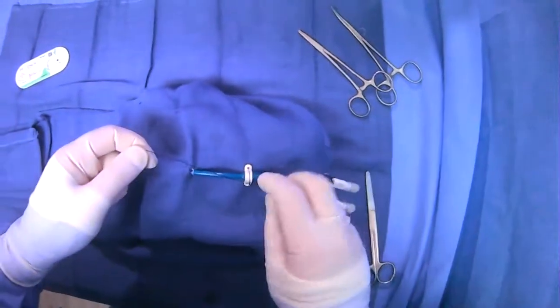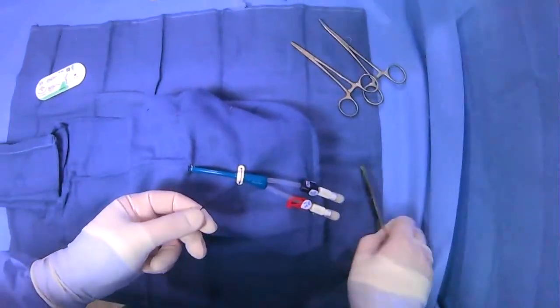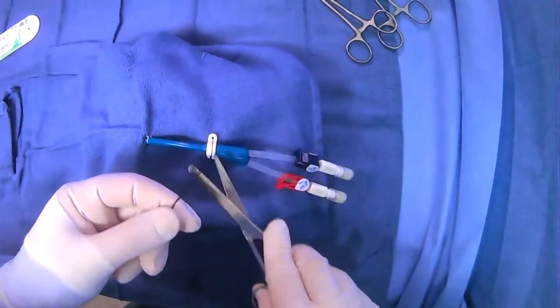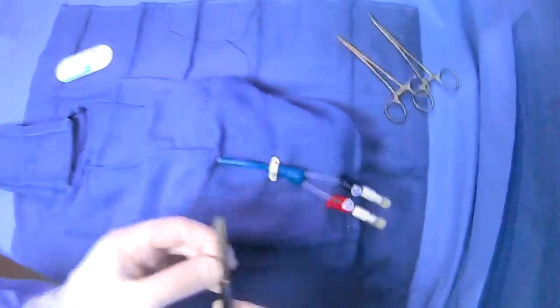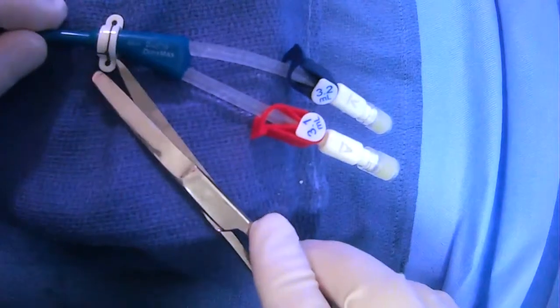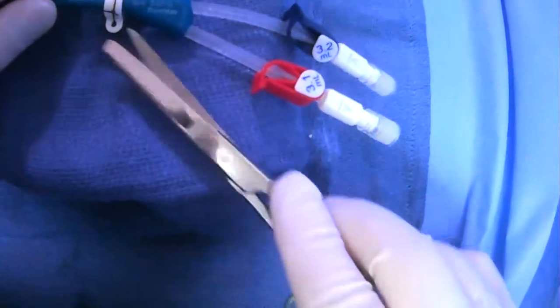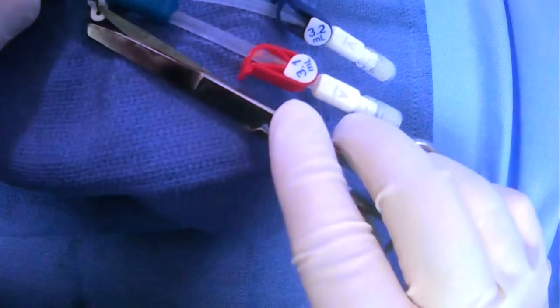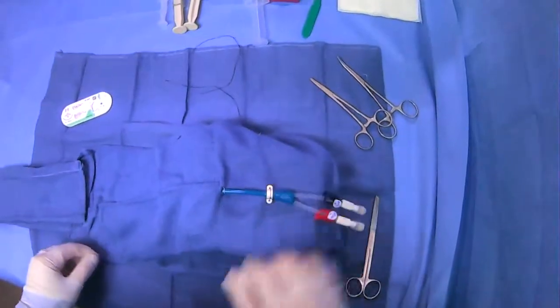Now, if this suture breaks, you only have one suture — but basically you're done. And then if you ever need to remove it, it's very easy. There's just room here. You don't need an air knot, and you're not going to cut underneath. You're just going to cut along the suture right there. So I think this is one pretty elegant way to suture these tubes in place.